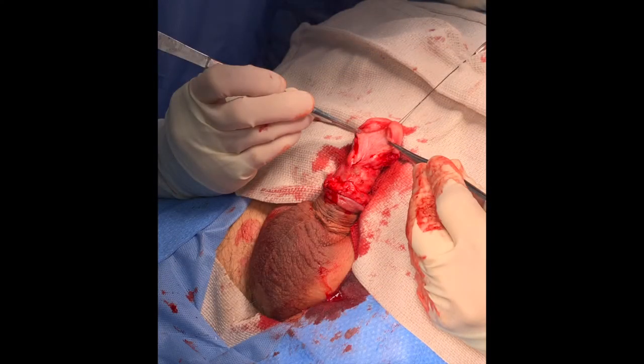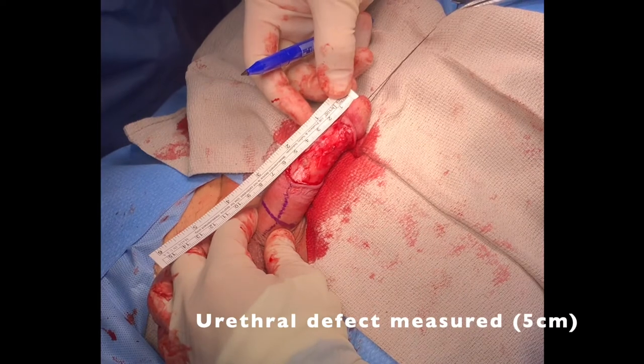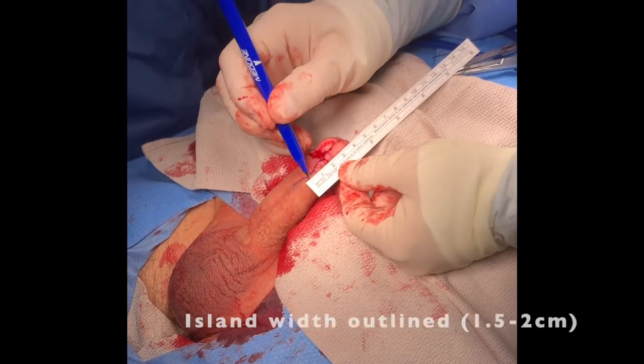Following this, we placed a 16 French suprapubic tube. We measured the length of the urethral defect, which measured 5 cm.